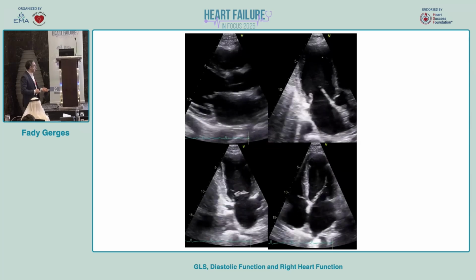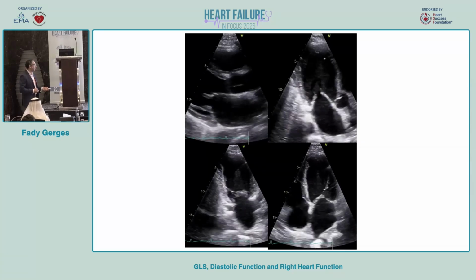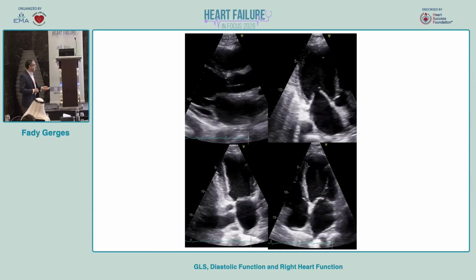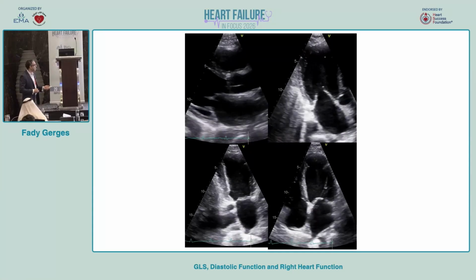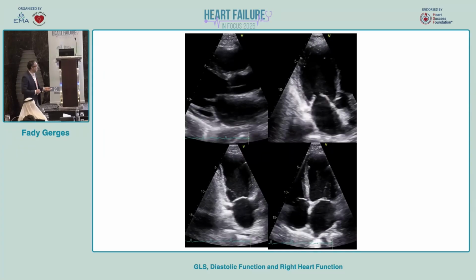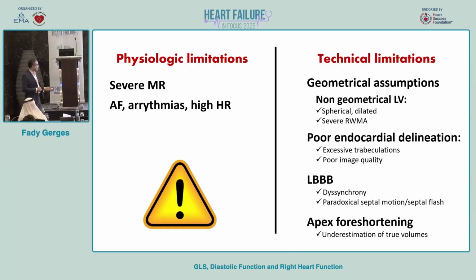However, for this patient, if you take a look by just the eyeball, you can see there's something wrong. The apex is completely dyskinetic in all the views, 2 chamber, 4 chamber, 3 chamber. So probably this patient had cardiomyopathy. So how to get a good, meticulous estimation of the ejection fraction?